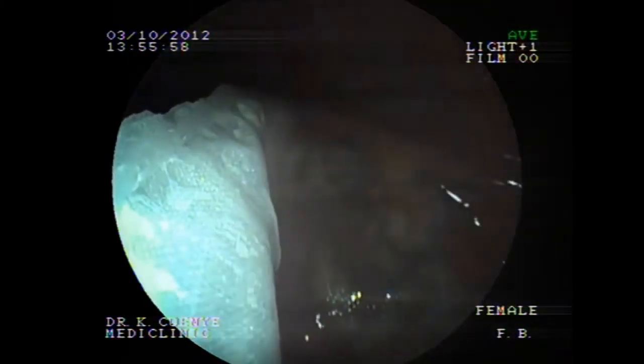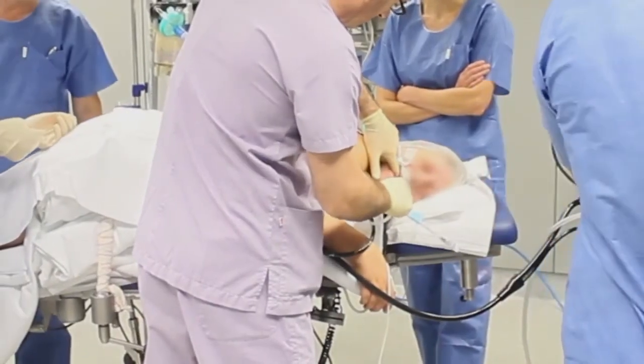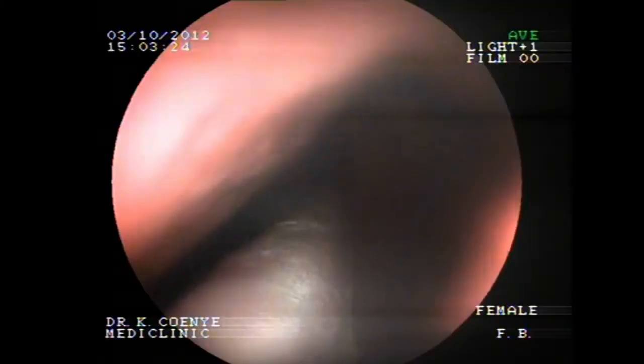With the help of the graduated catheter, gently pass through the esophagus to the stomach. The doctor should keep his index finger in the patient's mouth to help avoid bending the catheter. Should you encounter difficulty during the balloon's passage through the esophagus, avoid forcing with the catheter, as this would cause the catheter to disconnect from the valve of the balloon, rendering the system unusable.